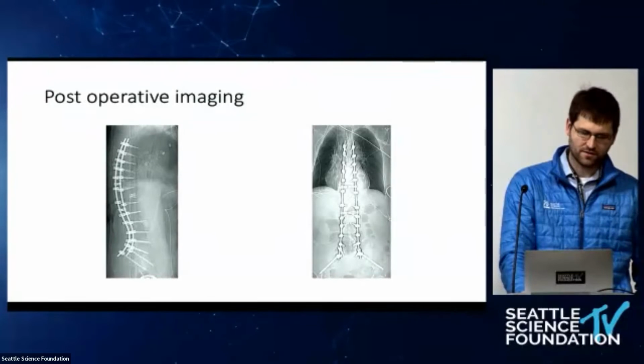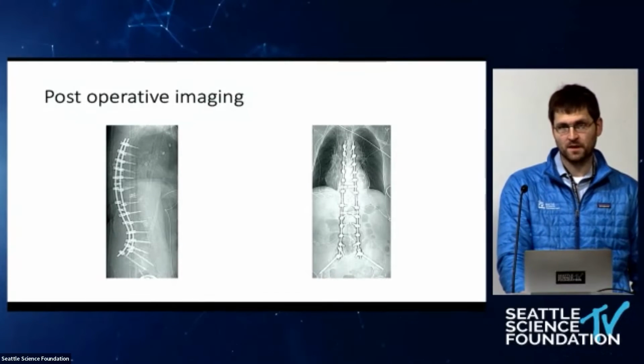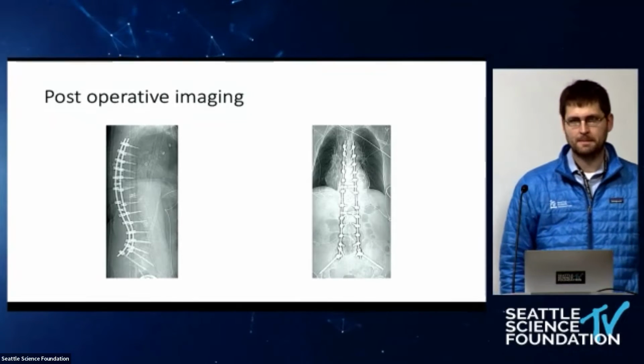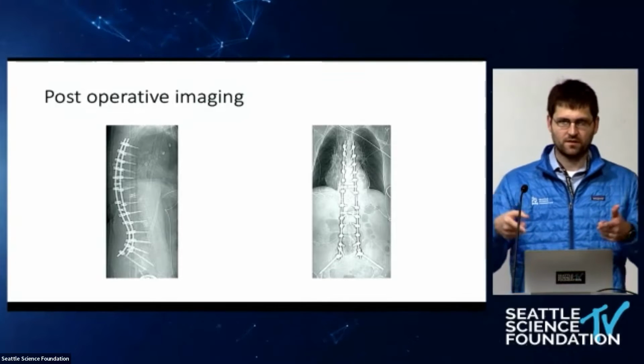So, thoughts on the construct. You have to have some anterior support, which you did. I didn't see exactly what that was. It's actually an expandable T-lift cage, expanding to about 17 millimeters. So you kind of went in through a T-lift, took the facet joint off, and just kind of came in from both sides.